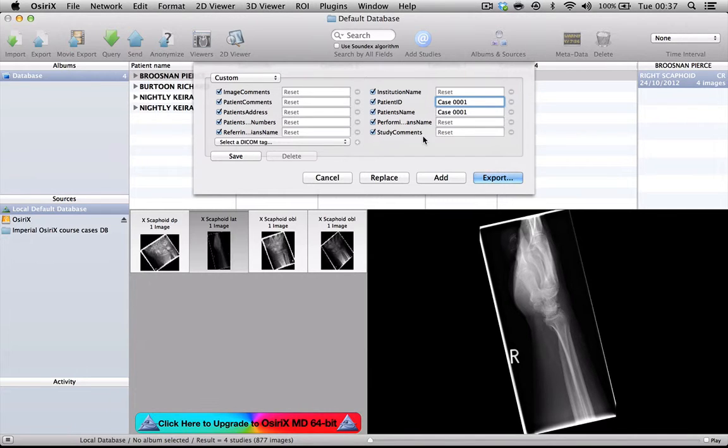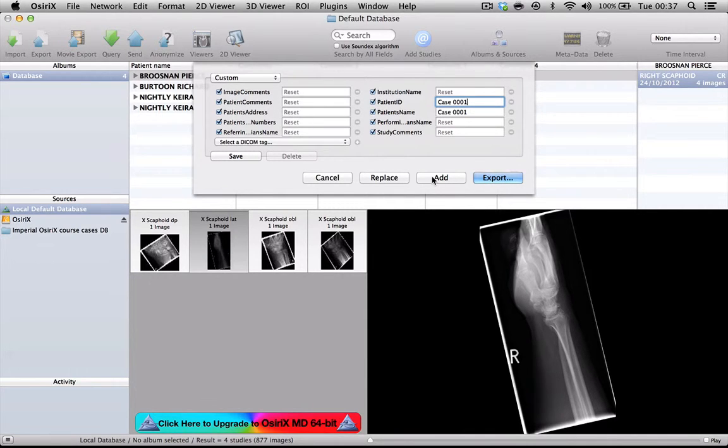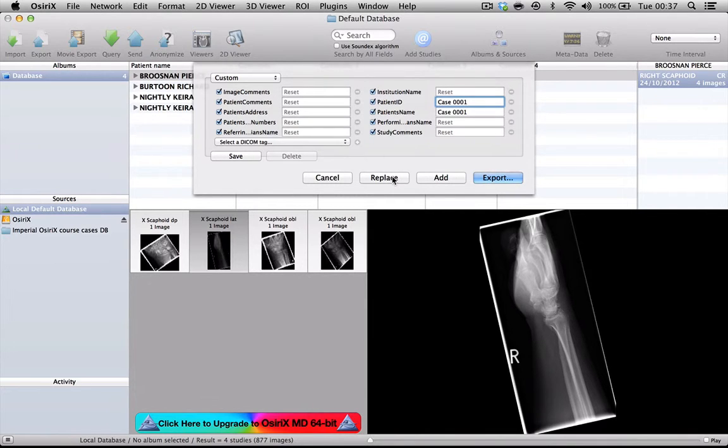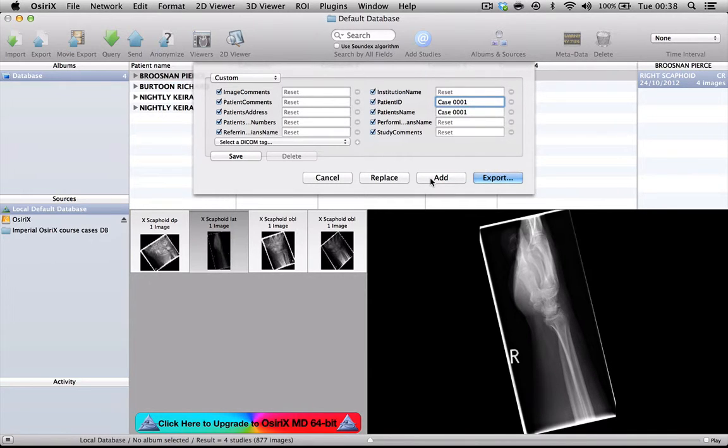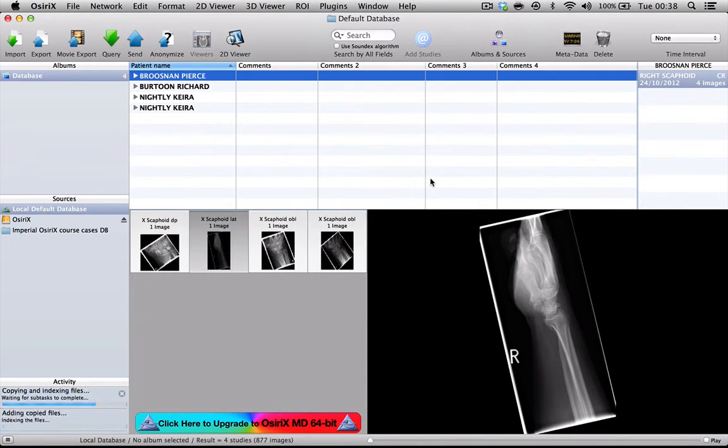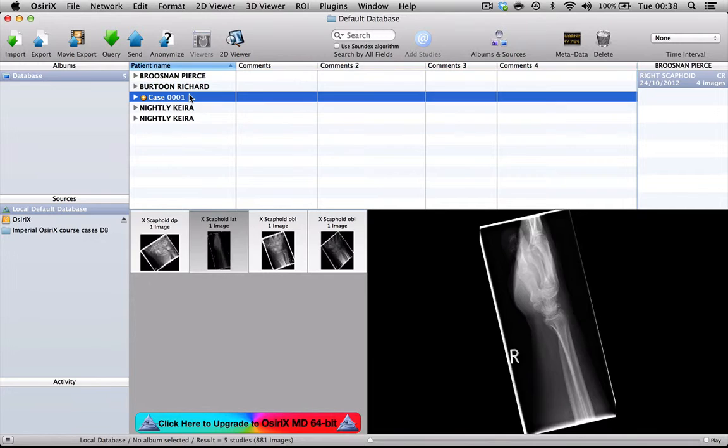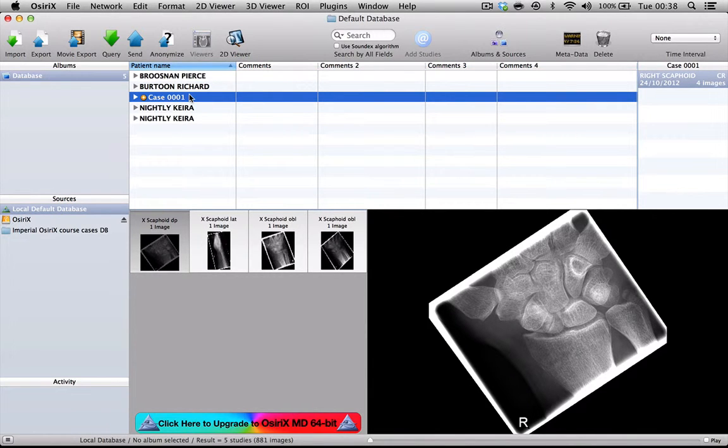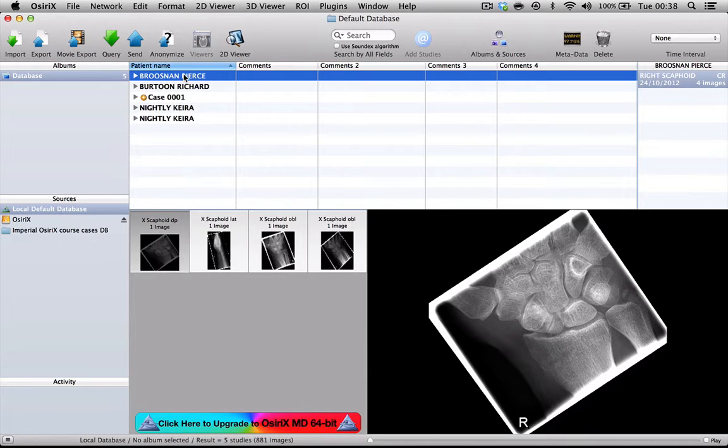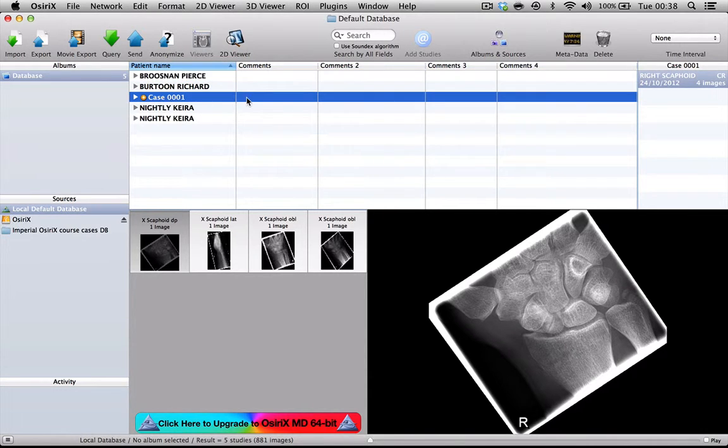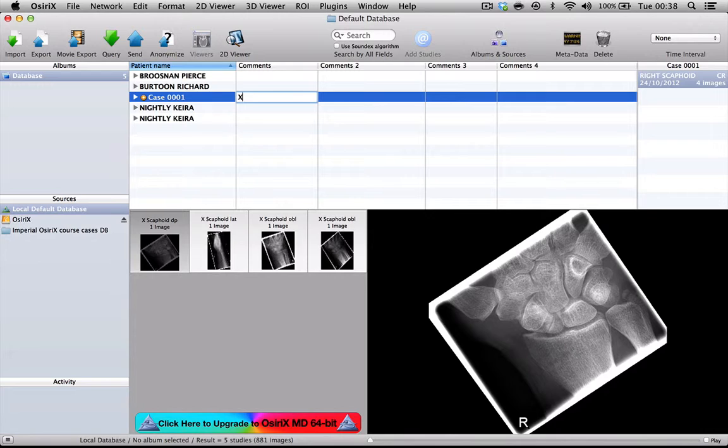At this point, we have an option of either adding the anonymized case onto the database in addition to the unanonymized case or completely replacing the original case. I tend to add, just in case everything goes wrong and I've still got the original case there. If we press add, you will see that now we have got a second completely anonymized case that goes alongside the case that still has the patient's name. We can now enter the rest of the information that we want for our teaching collection.